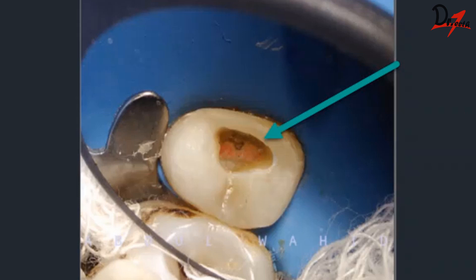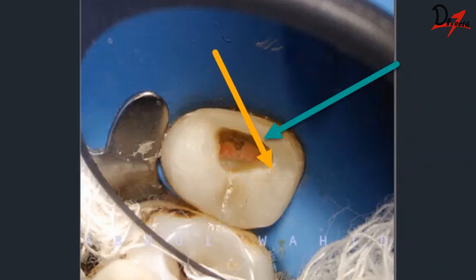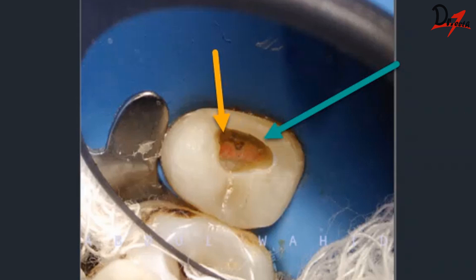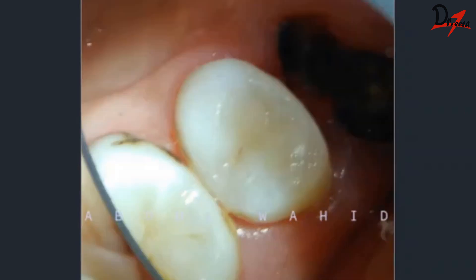Root canal treatment does not end at proper obturation — what we have cleaned and obturated must be preserved. A poor post-endodontic restoration will lead to leakage of saliva and food particles, which over time can result in failure of the root canal. Our duty is to preserve that obturation with a proper post-endodontic restoration. Here, a proper post-endodontic restoration was completed with composite material.